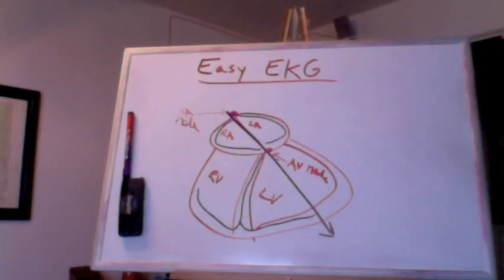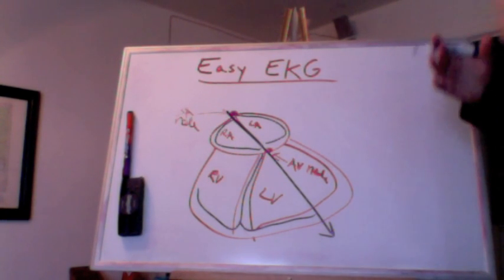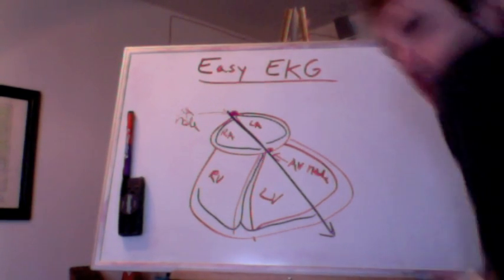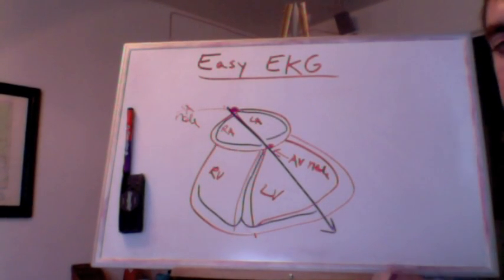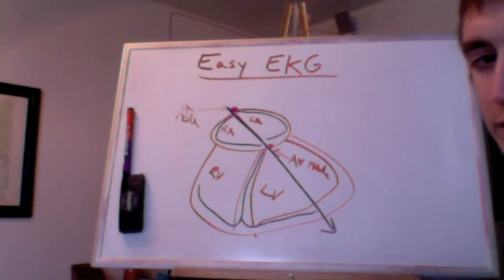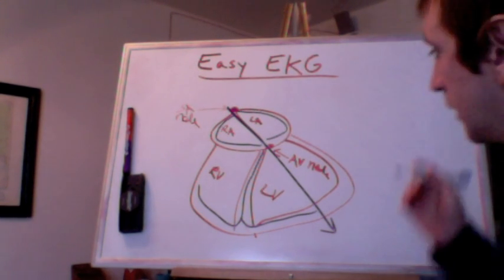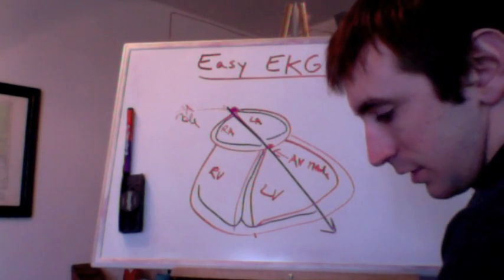Now we need to talk about the EKG form. Okay, so first off, and then we'll get into Einthoven's triangle, which is another thing that you have to understand. But after that, it's essentially it, and we can look at some EKGs and we'll interpret them together.